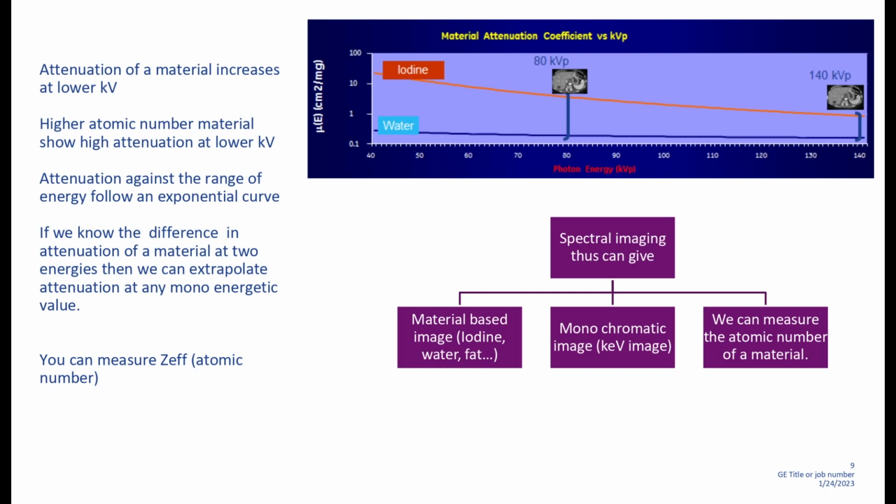Okay. Whenever we do the case with virtual non-contrast, would that be better rather than taking an NCCT? Which will be better, whether to go for an NCCT or virtual non-contrast? That is our question. Okay. To see, there are a few things. We want to see the lesion and identify the lesion better. Then monochromatic images at low energy is good.